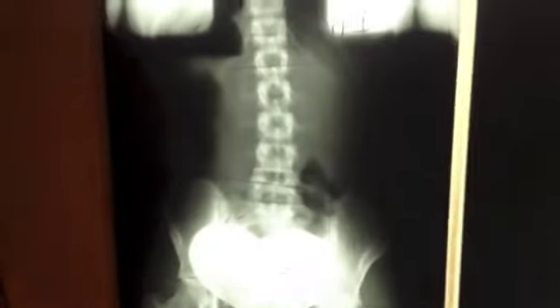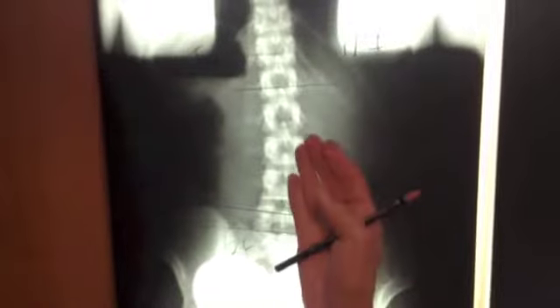So this would be a PR. This pedicle would be narrower and this one would be wider. This one is closer to the edge of my face. This one is further away from the edge of my face. So you can see more of this edge. So think of it like a face. So this is PRI.